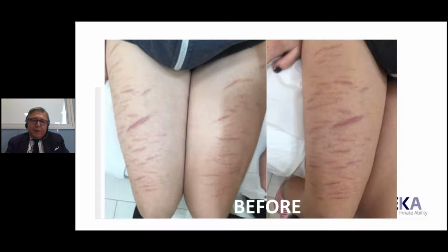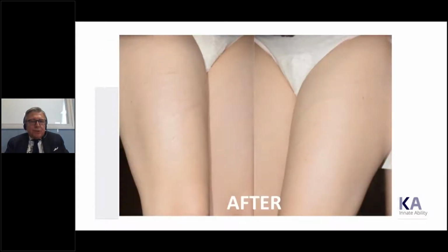There are self-inflicted lesions with the following red scarring, sometimes with a very thick fibrotic lesion, before the treatment where we combined pulse dye laser, Vascu from Deka, and fractional CO2, Smartxide 2. And you see after the first procedure with the pulse dye laser, 1 month of interval apart, second treatment with the fractional CO2, and then the results.